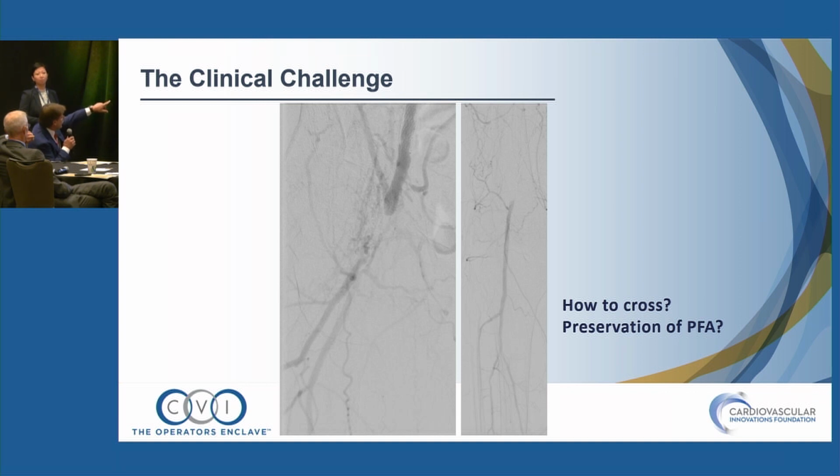I would try to get across into the profunda, open that up, and do some definitive therapy. I would also talk to the surgeon first. What I mean is, did you ligate the femoral or the SFA before I start mucking around in there? I've had that a couple of times, and even my hands won't get through a surgical stitch. So I would ask the surgeon, what was your technique? What did you see? What do I need to know from when you were in there?